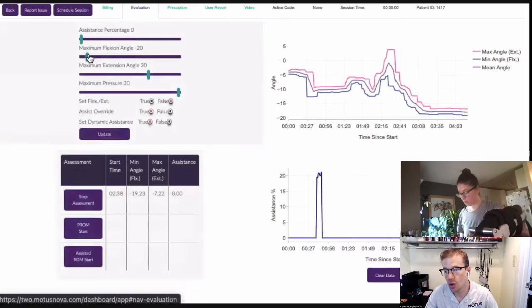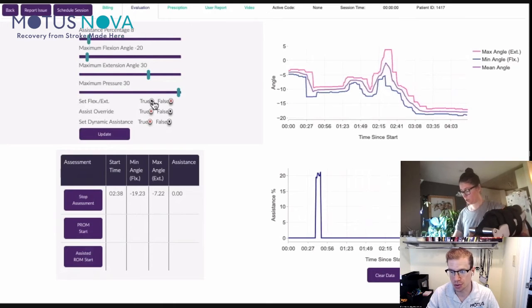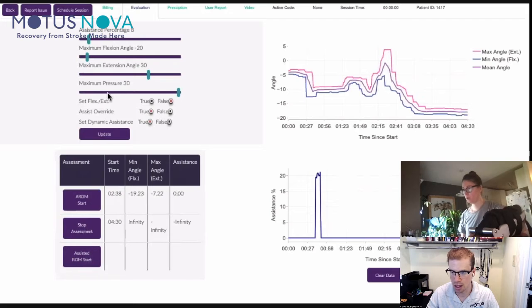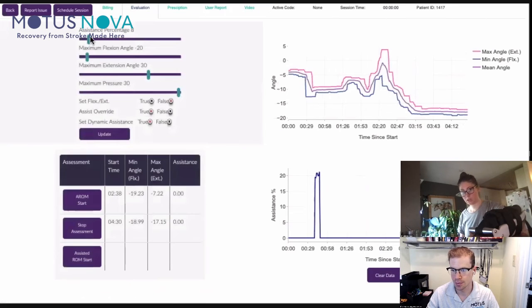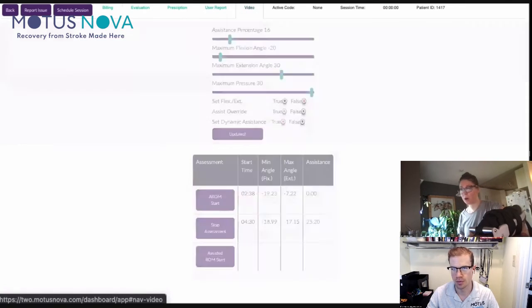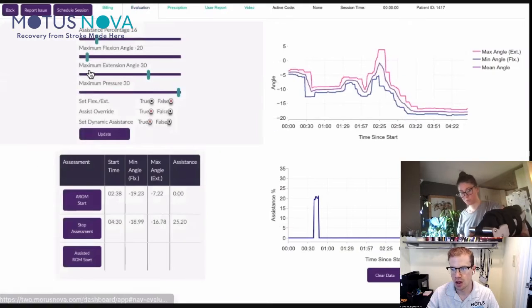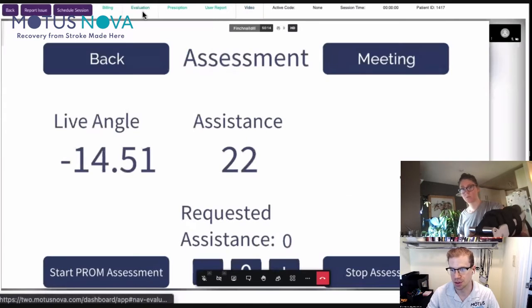So next thing, let's go ahead and actually try to do a bit of a passive range of motion check. So I'm just going to move your hand and wrist. Just do your best to relax here, and just let me know as soon as you feel any movement in your hand, okay? Yeah, a tiny bit. Tiny bit, okay, very good. Or no, I can hear it, but oh, there we go. Yeah, perfect, okay. It is kind of a cheat because you can hear it move you, but it doesn't always move you every time it pumps.